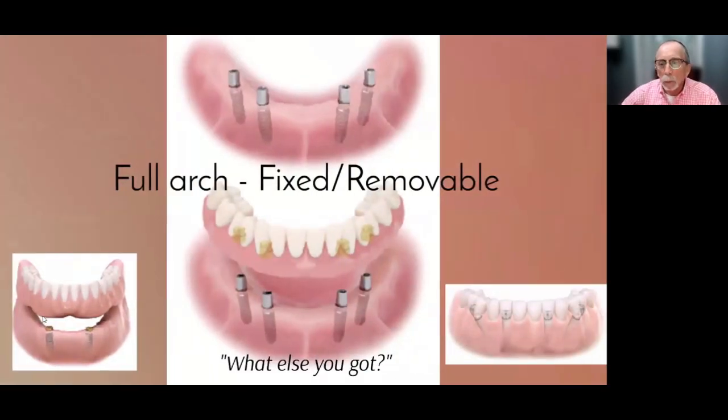The third one would be the fixed removable, which is fully implant supported, implant borne, but yet the appliance is removable. And there are some needs for this as well. And we'll talk about those. But it's nice having the third option.